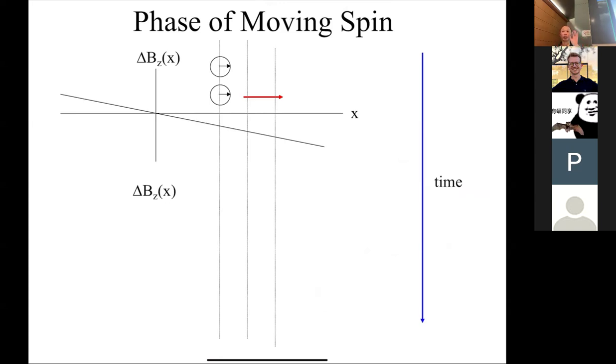So it's just a pure question of whether you are willing to spend more time. It's sort of a no-brainer if, for example, you're at the scanner and you don't have much time and you just need this image to look a little better, then the simplest thing is just to double the NEX and just hope that that works, right?